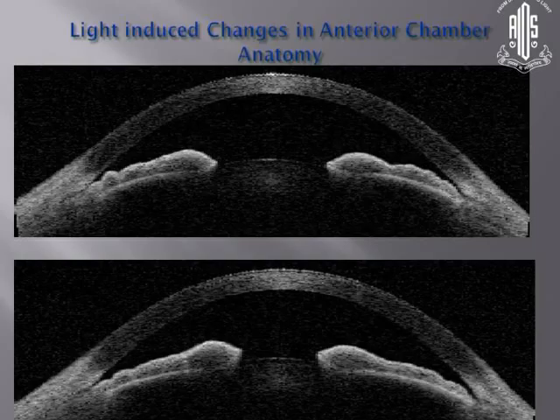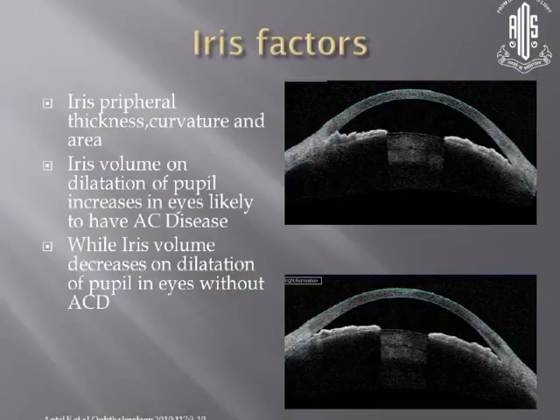Look at this, a beautifully depicted picture. It's my own patient's. This is the pupil. We have thrown the light on the pupil, the constricted pupil, and this is a little bit of dilated pupil. You can see that this angle is appositionally closed. When the pupil is constricted, this angle becomes open. So that is an important thing, you know. If you put the gonioscope, probably you may not see that, but with the ASOCT, yes, you can do that.